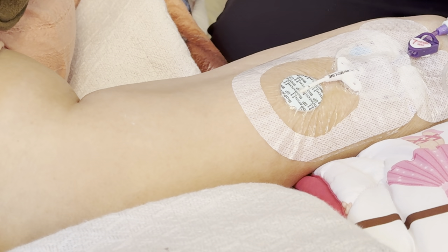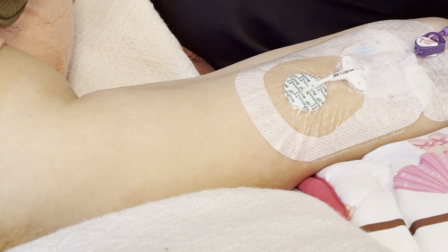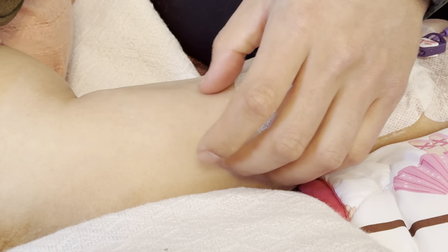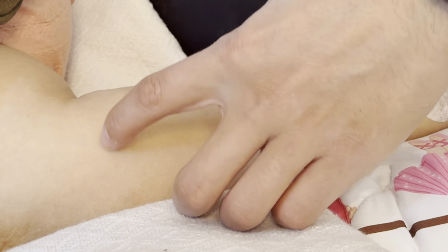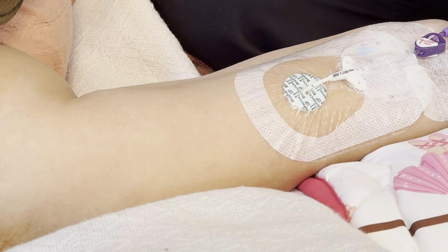Here we have a patient with a cephalic insertion. It's difficult to tell what the catheter-to-vein ratio was at the beginning. I'm going to assume the clinician put in an appropriate catheter-to-vein ratio. However, when assessing it today, you're going to see the ratio is grossly inappropriate. In my experience, the cephalic vein seems to spasm or decrease in vein size significantly the majority of the time. This is why I prefer the 22-gauge 6.4 cm catheter for this vein — there's enough catheter-to-vein ratio when the vein does spasm. I always plan for the cephalic to spasm and get smaller.